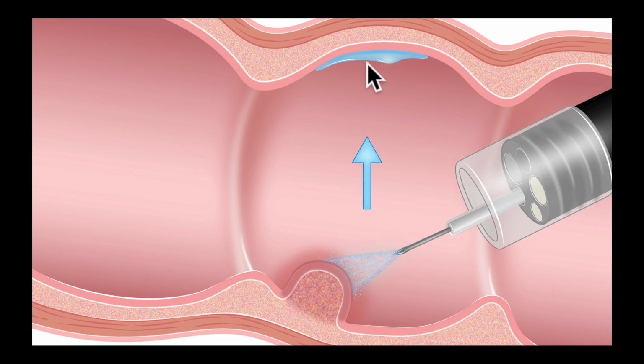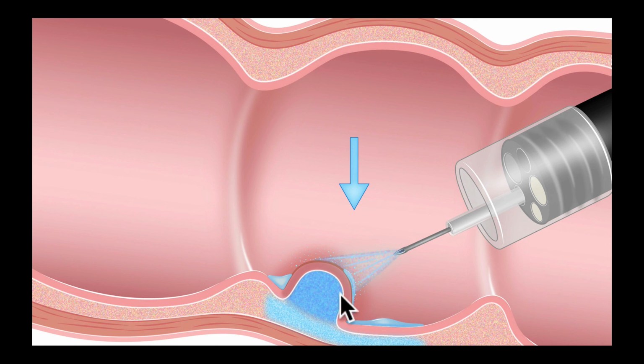And if that is the case, you could go ahead and do the resection, and bleeding can be easily seen and taken care of. On the other hand, when the fluid puddles around, that means the lesion is dependent, and you should change the position of the patient so that if bleeding were to occur, you could easily find that.